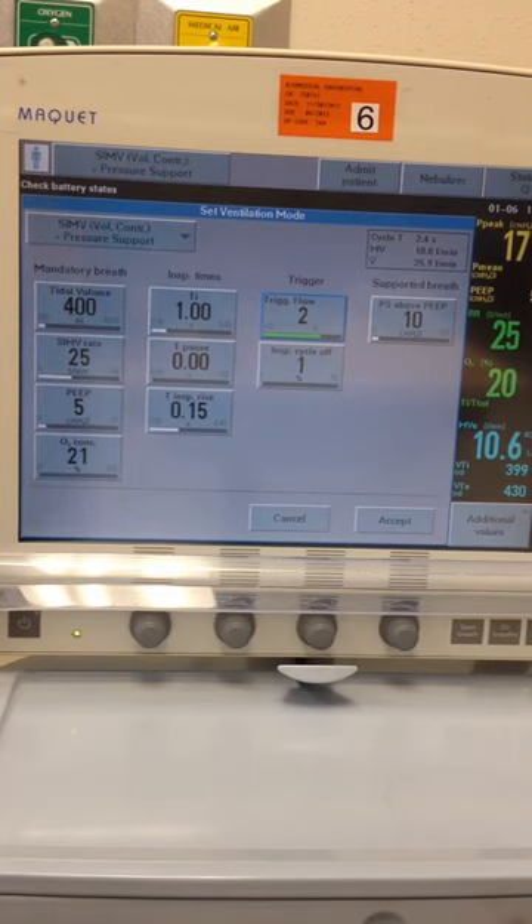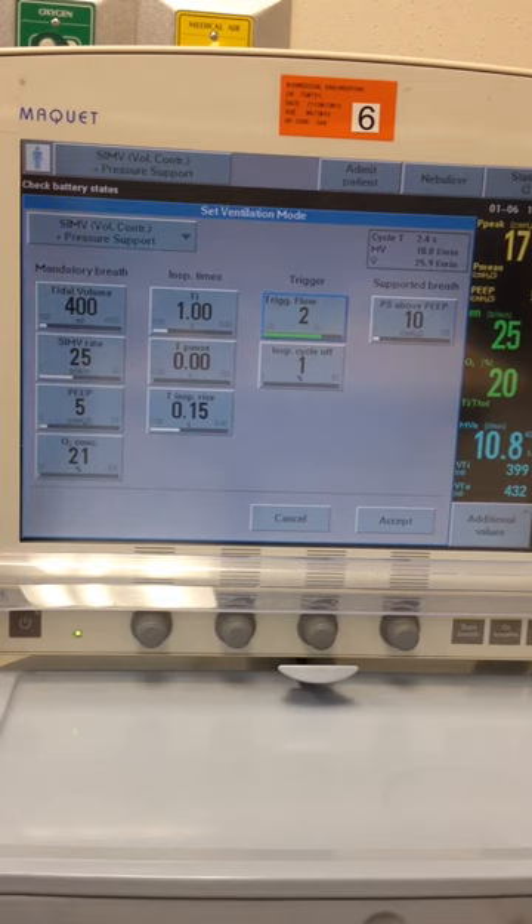Next we're going to do the SIMV volume pressure support mode. We're going to leave our compliance at 40 and our resistance at 5, and we're going to set the following parameters.